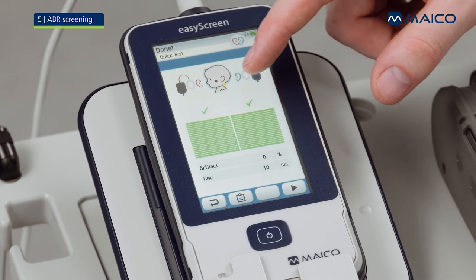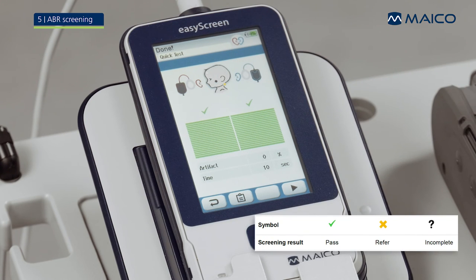If the baby passes the test, the EZ-Screen will show a green check mark. If the baby does not pass the test in a specified amount of time, the EZ-Screen will show an orange cross.